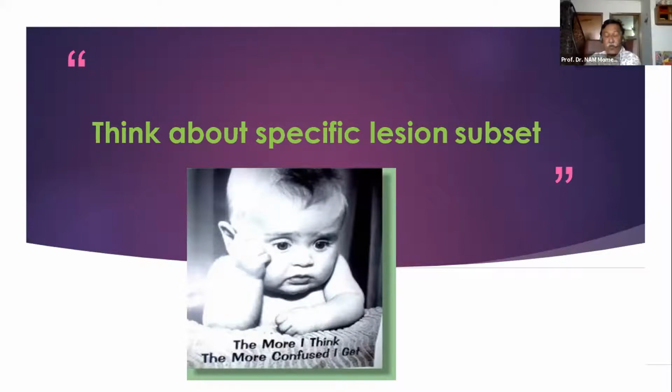I said that for 4 millimeter and above, there is no difference between drug-eluting and bare metal. So we have to ask the companies that it should be available. But none of the companies is interested, because the margin is less. The problem is that they have to keep the margin.